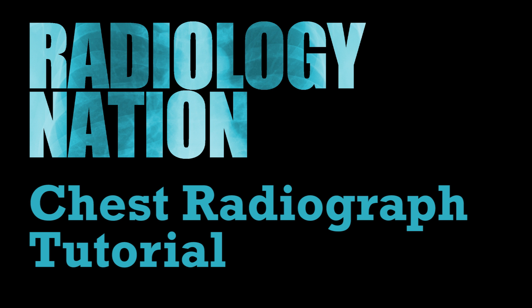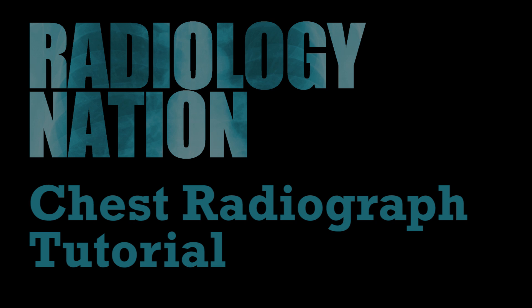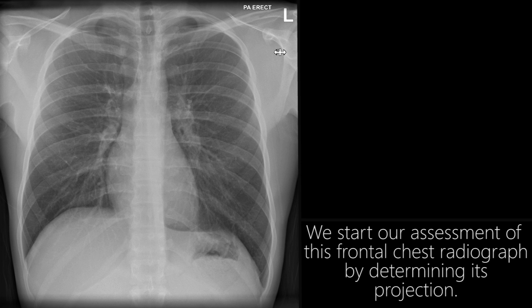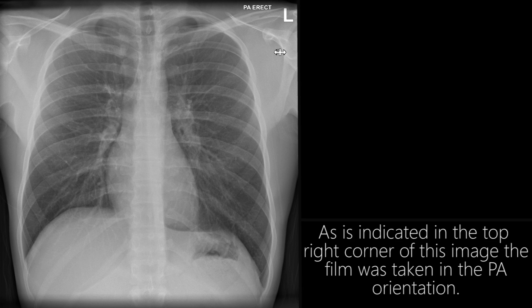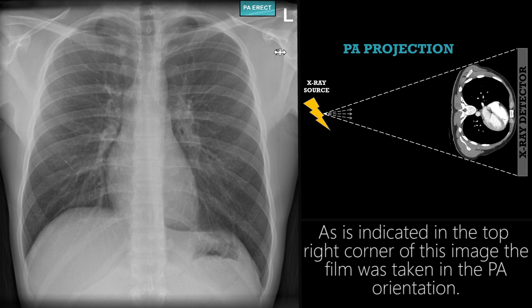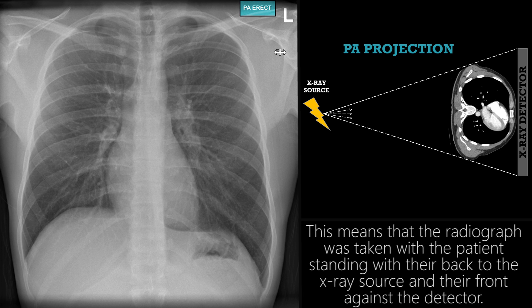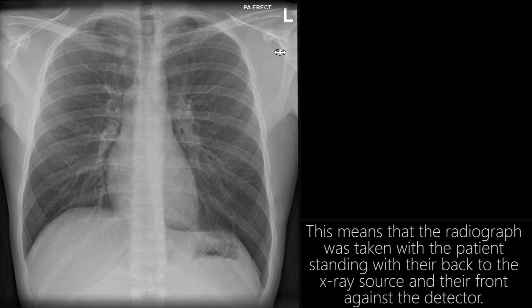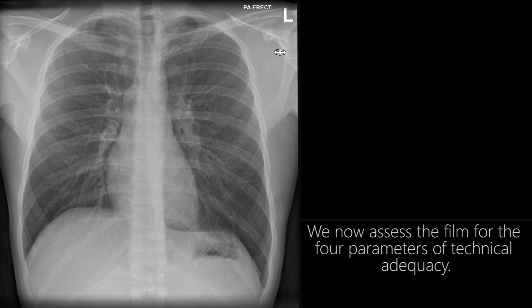Welcome to this tutorial on chest radiograph interpretation. We start our assessment of this frontal chest radiograph by determining its projection. As indicated in the top right corner of this image, the film was taken in the PA orientation. This means the radiograph was taken with the patient standing with their back to the x-ray source and their front against the detector. We now assess the film for the four parameters of technical adequacy.